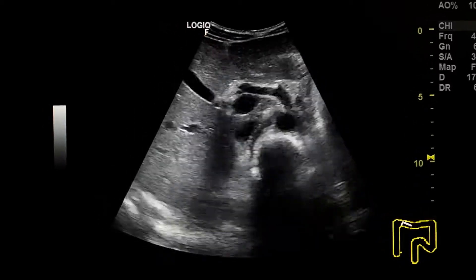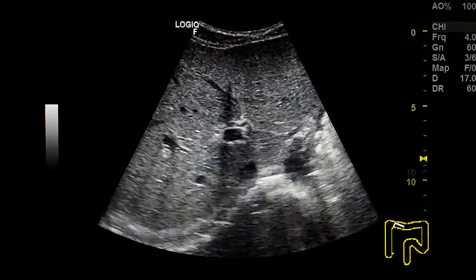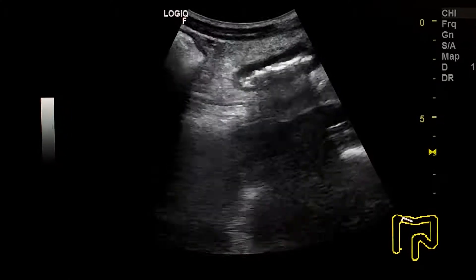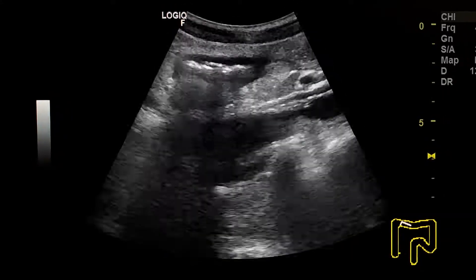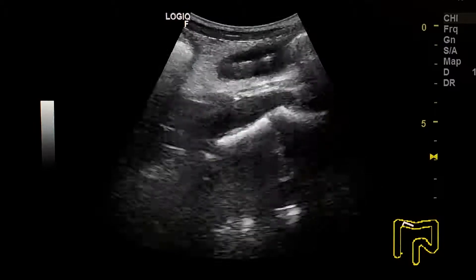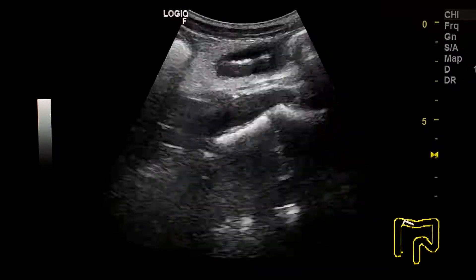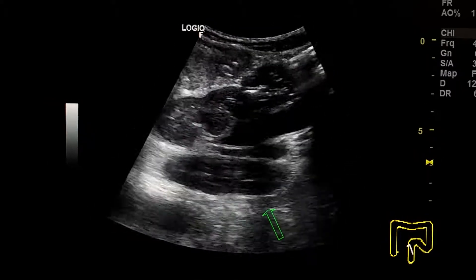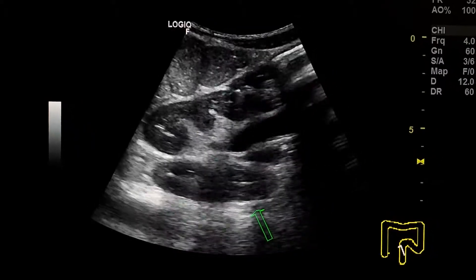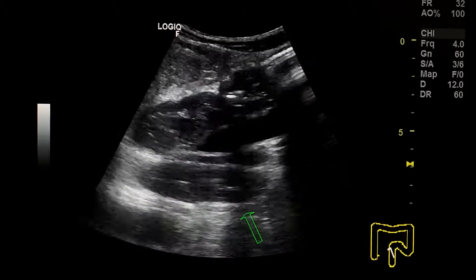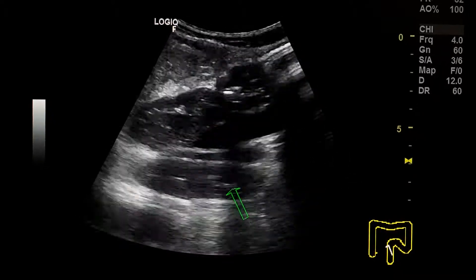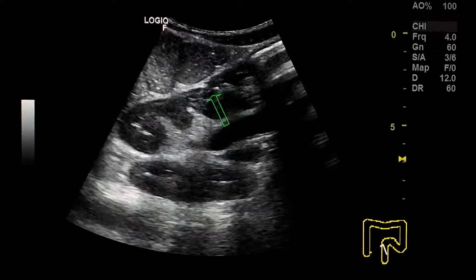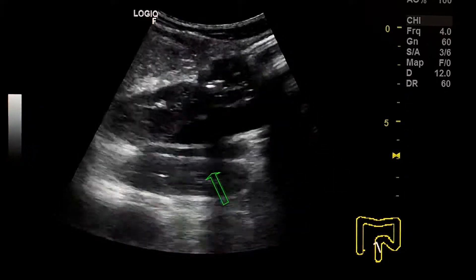Normal liver, gallbladder, and pancreas. This is the transverse colon at the level of the hepatic flexure, and this is a sagittal section at the level of the gallbladder. We see the sigmoid colon and rectum here.